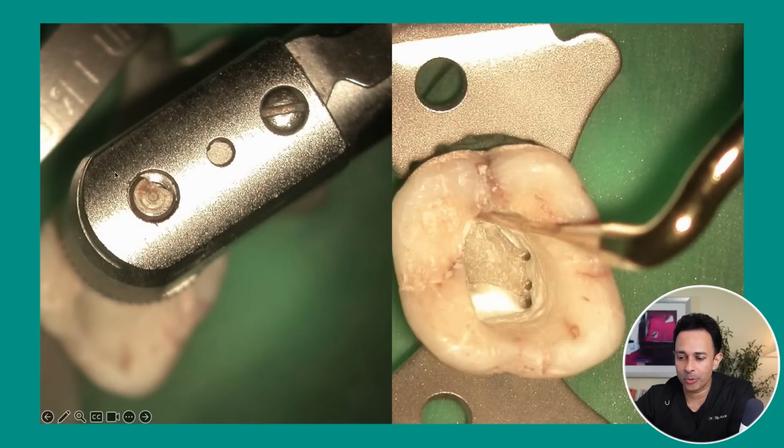So if you're using a micromotor, the design of the handpiece is such that the head of the handpiece and the burr are in the same plane, whereas the ultrasonic handpieces are designed in such a way that you get a lot more access and visibility. So they're much easier to use, but the disadvantage is that A, they don't cut as aggressively, and if they do cut, then they are usually diamond-coated tips, which are expensive and they wear away with time, and they are not as aggressive compared to, say, a high-speed handpiece.